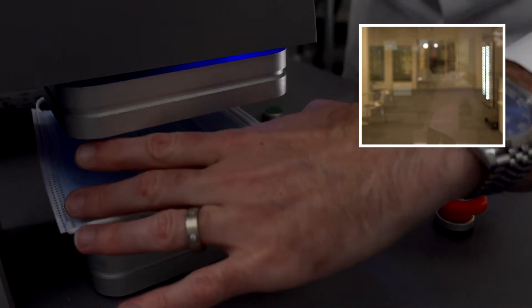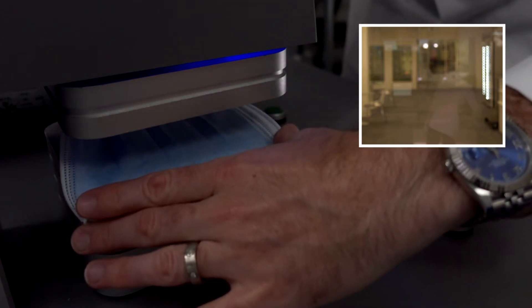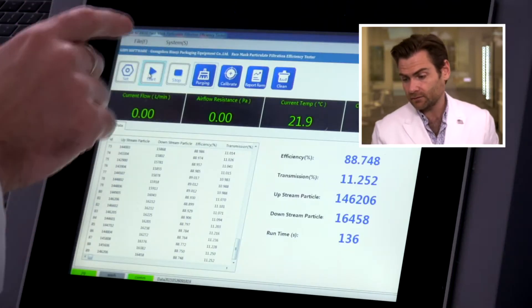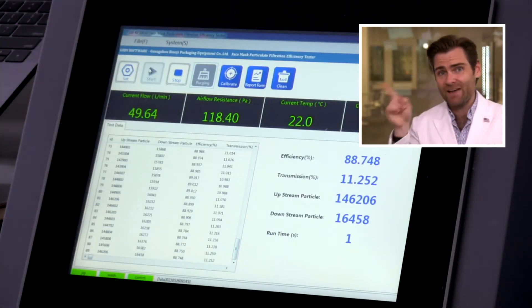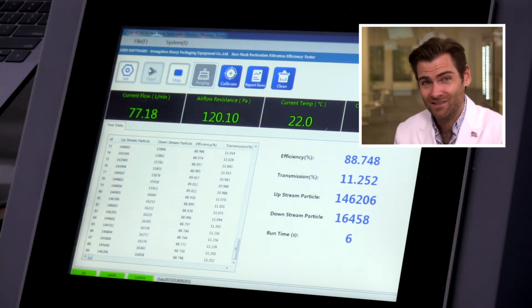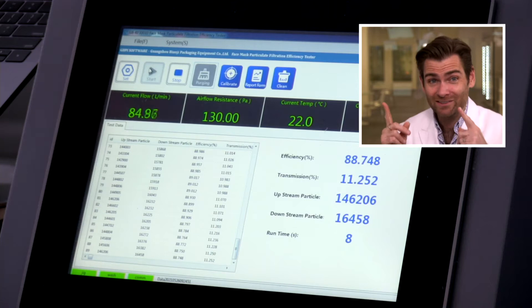This is a blue and white mask, very standard. Let's let it rip. This is a PFE machine — particulate filtration efficiency. If you want to know why we're doing this test here and you don't know, look at the link.